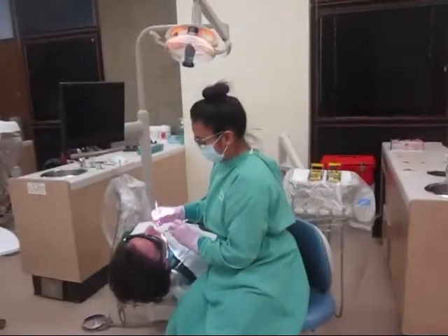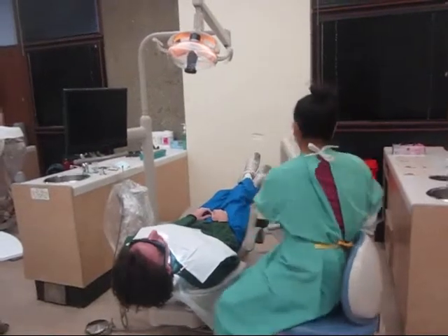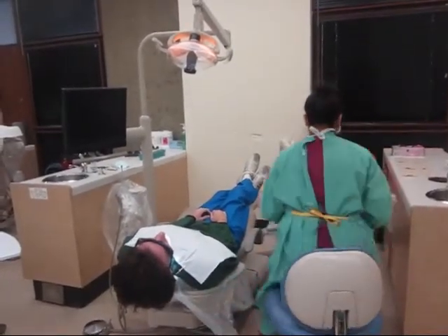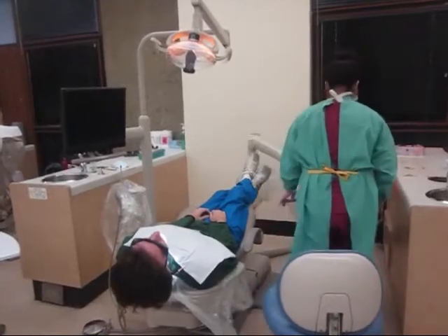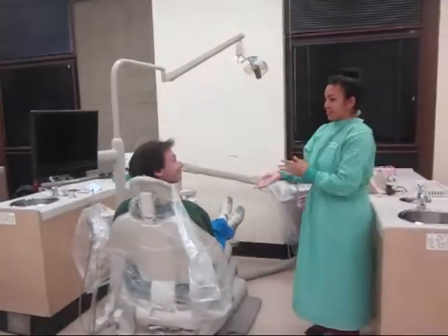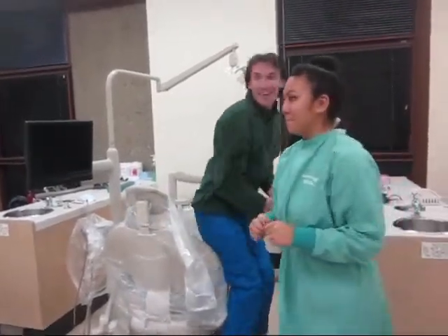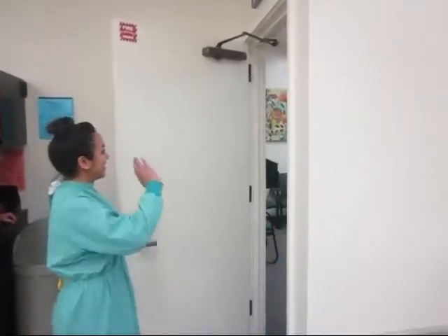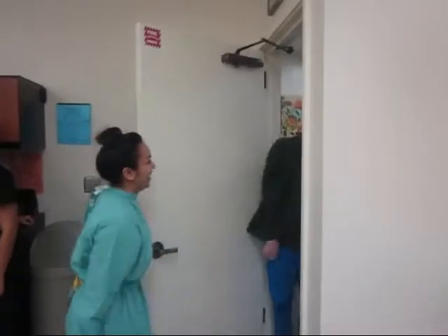Frances is hard at work, exploring and improving her new patient today. Frances understands the importance of infection control. Her patient trusts that Frances will only use the safest methods. Frances has just dismissed her patient. Let's see what happens next to the contaminated instruments.